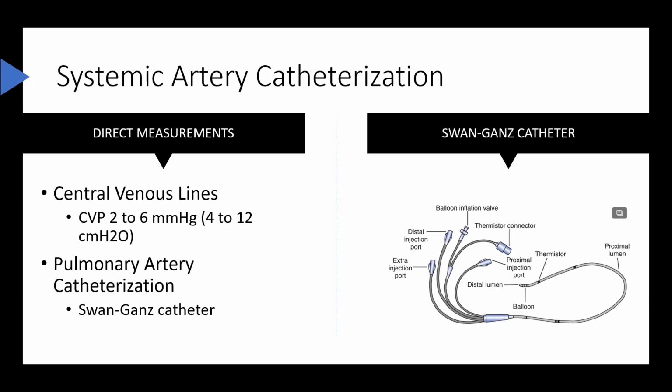Distal ischemia should be suspected when pallor distal to the insertion site occurs, particularly if it is accompanied by pain and paresthesia in the affected limb. The most common cause of decreased perfusion is thrombus formation, which occludes the catheter tip. Other risk factors for acute distal ischemia include hypotension, severe peripheral vascular disease, and the use of vasopressor drugs.